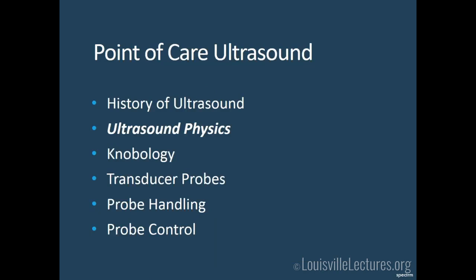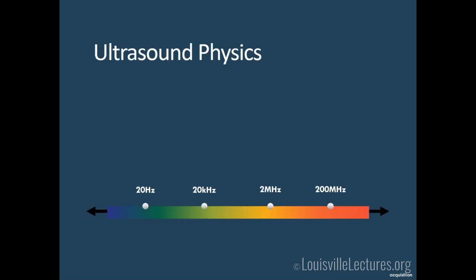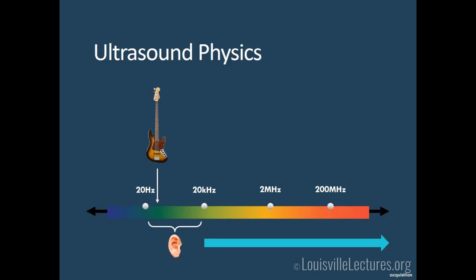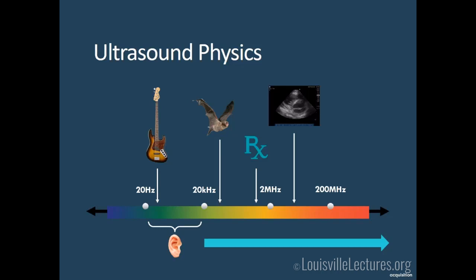This is the frequency spectrum of sound waves. Human hearing lies between 20 and 20,000 Hz. Everything beyond 20,000 Hz is ultrasonic. Very low frequencies near 20 Hz are low bass tones. Just above what we can hear is what animals use for echolocation. A little higher is used for therapeutic purposes like physiotherapy. Diagnostic ultrasound operates at much higher frequencies — that's where we live with a diagnostic ultrasound machine.